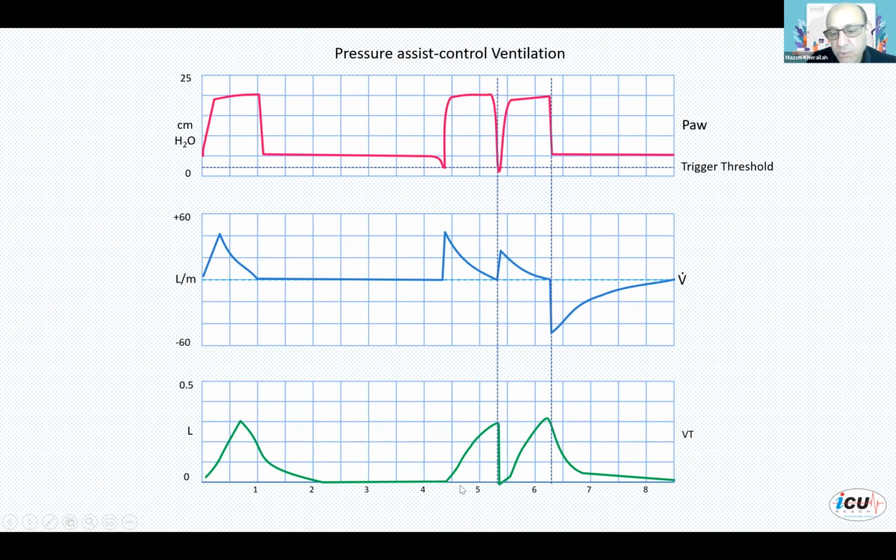However, since we have tidal volume already inside the chest, it resulted in lower peak inspiratory flow and lower tidal volume. This should have been actually lower than the first one. And the stacked volume will be the combination of the inspiratory volume of both breaths together.